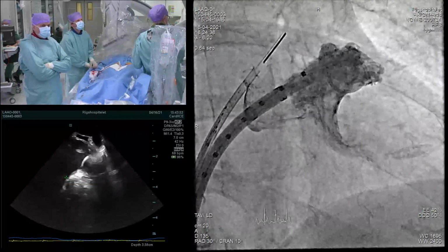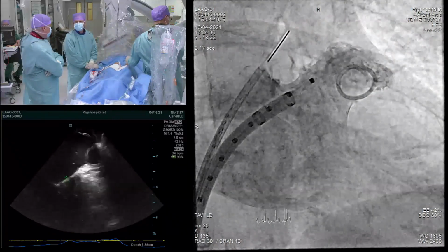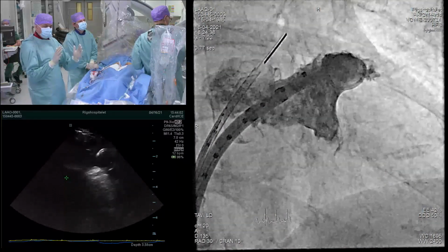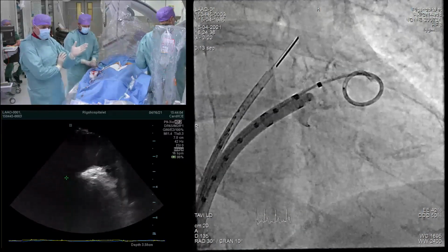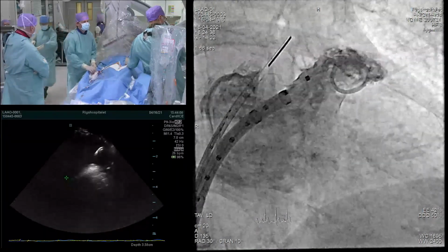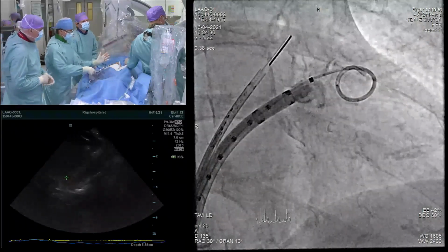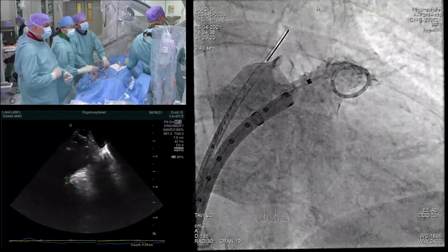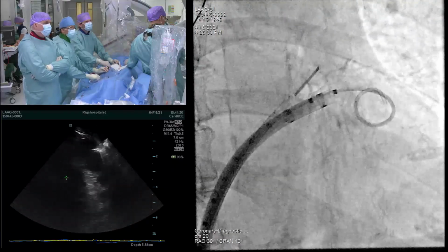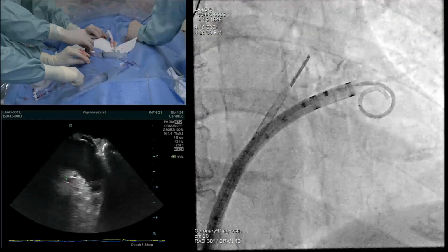So you see this chicken wing anatomy. And I think from the 3D model, what we could see, Ole, was that we want to implant it a little bit deep to have the best compression rate and also separation to the disc, so the disc actually has concavity and is going to seal off. So what Gintes is doing now, he's getting the device itself. It's loaded here. We go a little bit deeper first with the sheath. As I said, we want to have a little bit deeper implantation, and always advance this over the pigtail catheter.